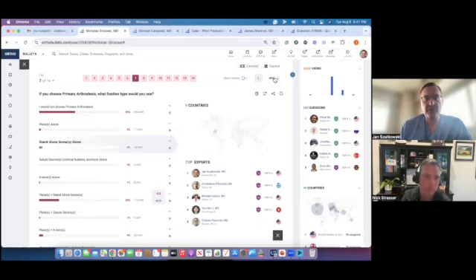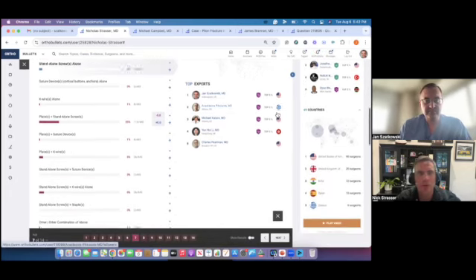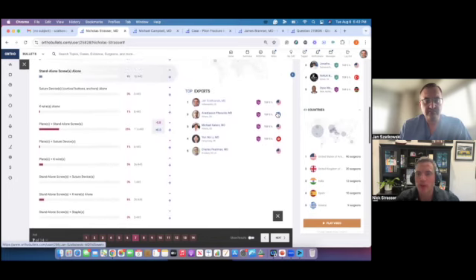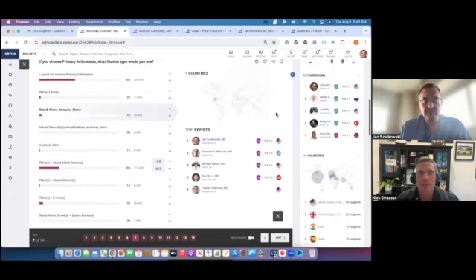So when you fuse, what do you usually use as your fixation construct? I've used plates, I've used staples, I've used crossing cannulated screws, solid screws. I think you go with what you're comfortable with, what allows you to get rigid fixation, get the alignment right, and then what's available. But in these kinds of cases, I kind of ask for everything. I'll have plates, staples, and screws, and then it depends on how it lines up and what the anatomy looks like.